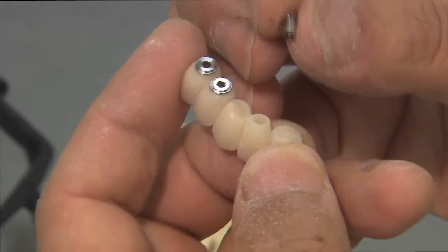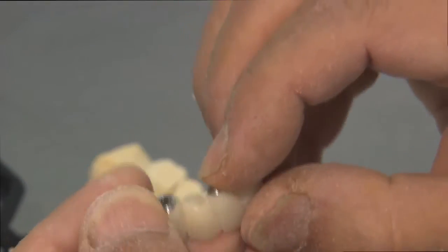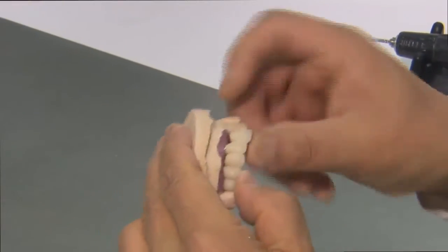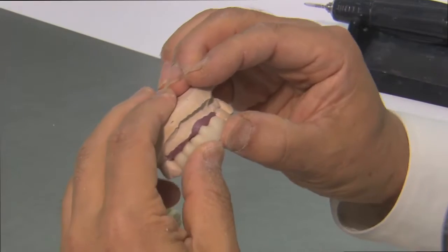Next, the technician places titanium copings in the access holes of the provisional. The provisional is then attached to the working model to verify the accuracy of the milled prosthesis.